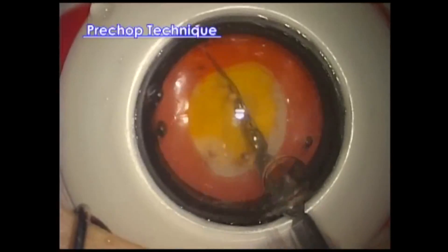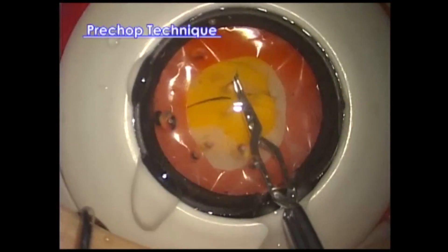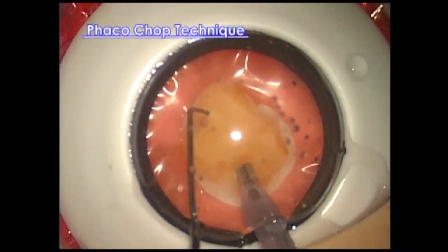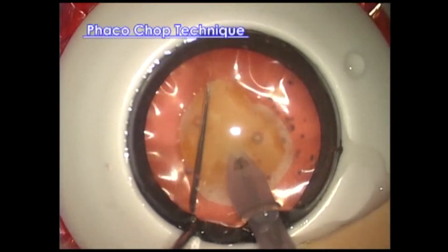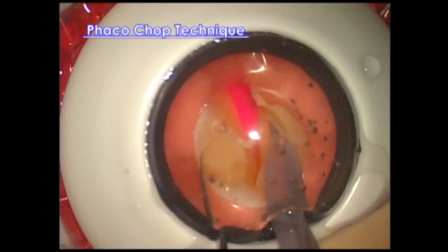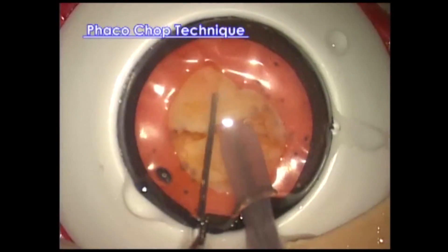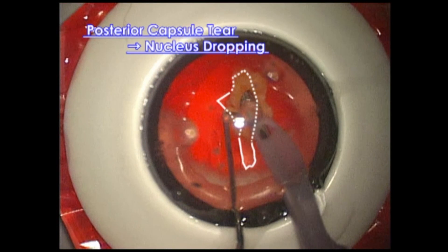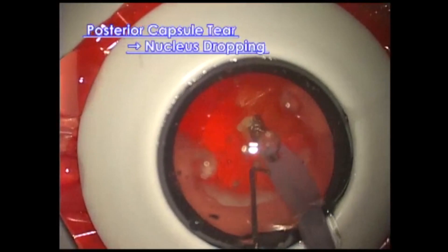This is nucleus segmentation with the pre-chop technique using the soft nucleus. This is a method to practice the phaco chop technique using the medium hardness nucleus. First chop. Second chop. In this case, posterior capsule tear occurred and the fragment almost dropped into the vitreous cavity. However, you can learn how to manage posterior capsule rupture.